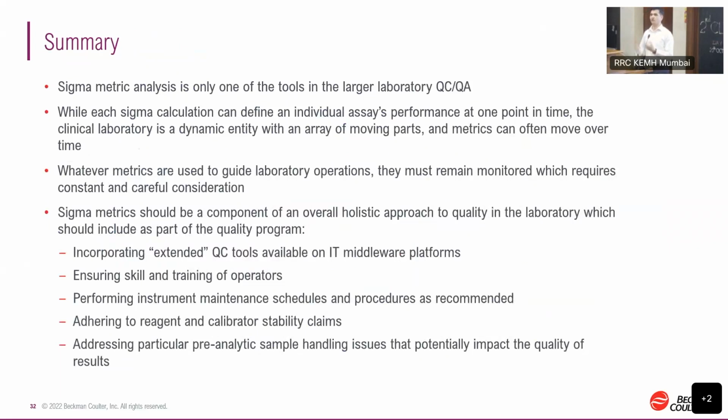So it's not a one-time job. You may set a frequency to assess the sigma performance, or decide the time accordingly.